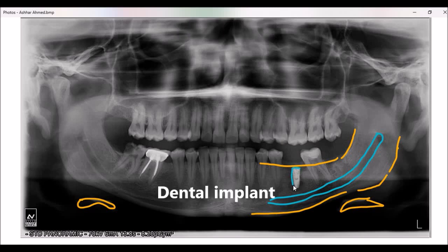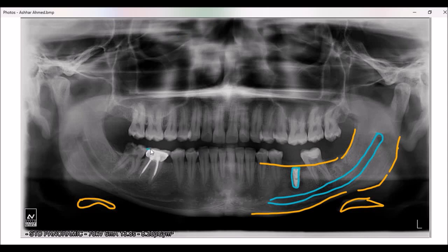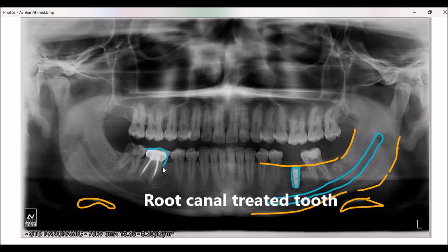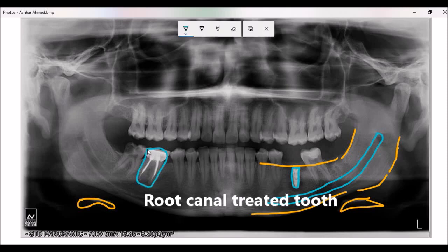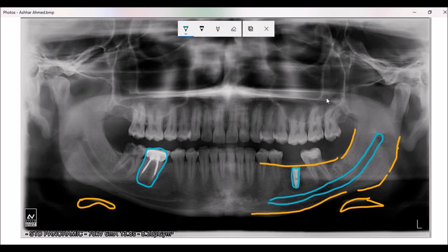You can see an implant over here — this is an implant. And this is a restored tooth, more precisely a root canal treated tooth with a crown. There are a number of other landmarks on a panoramic radiograph, but here I have only explained those that are very prominent.